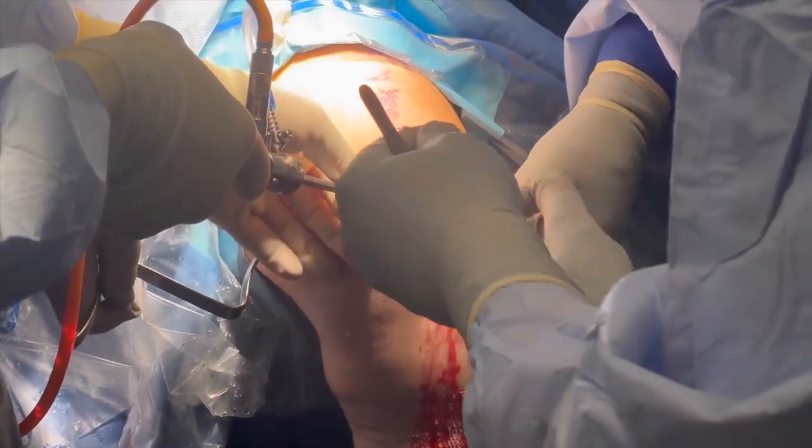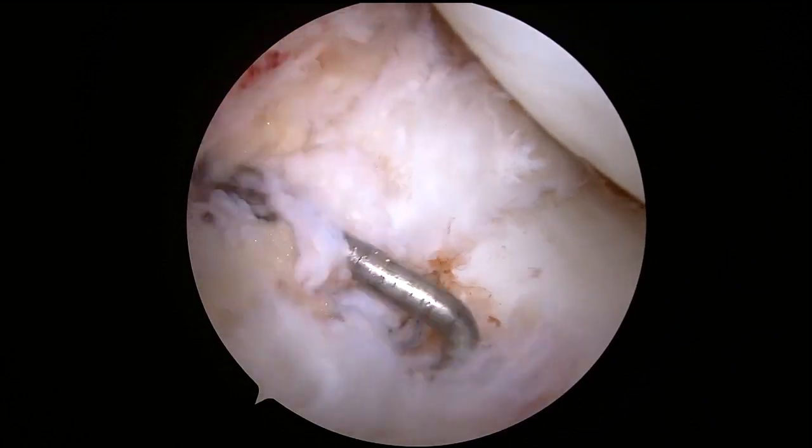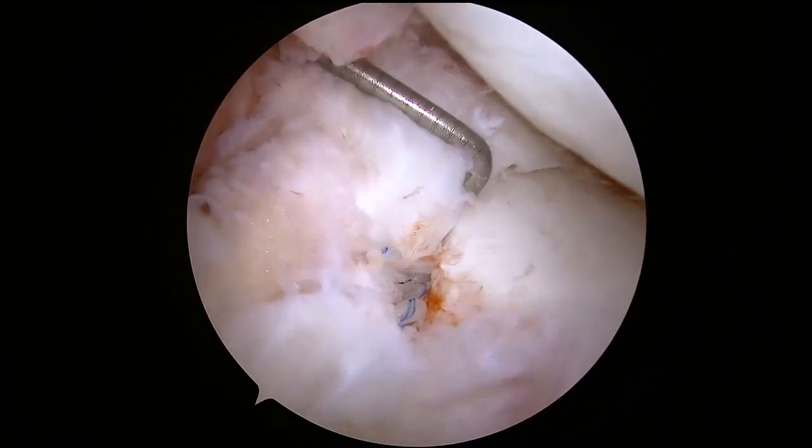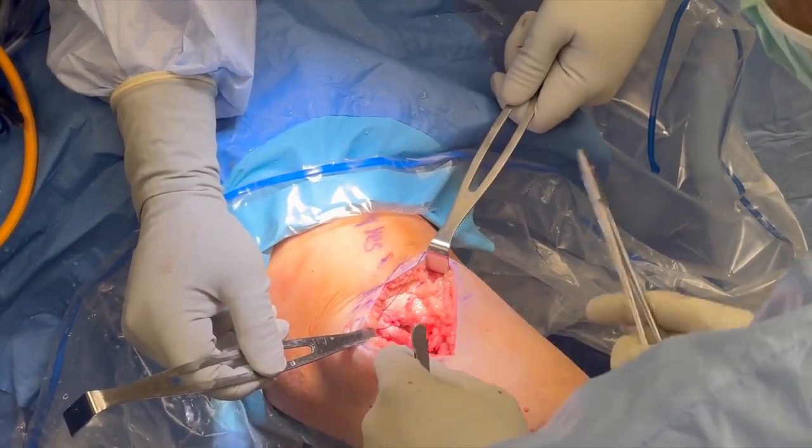The pairs of sutures are then tied down to form a solid and secure repair. The revision is then examined with a probe to evaluate placement and security of the repair. The deep and superficial tissues are closed with sutures.